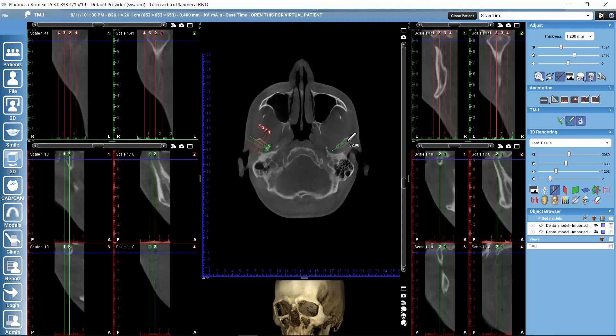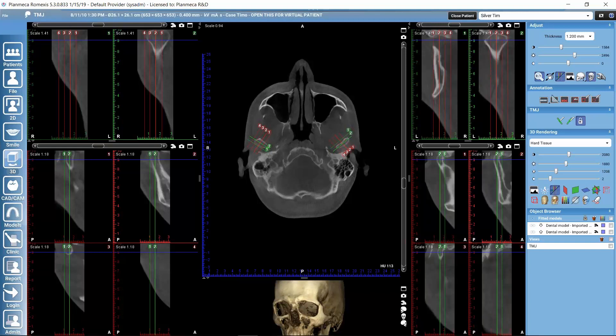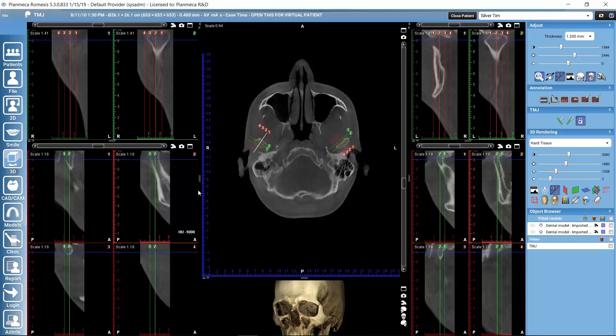To the other side, we can define the same lines. Now we see that we can't define manually the length. It's synchronized with the other side, so we can just define the orientation to the lines. If we take a look at these different slices that have been generated for us, we can see also if we move our mouse on top of the slices, we can see from where each slice was taken.